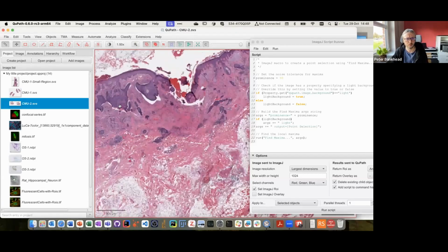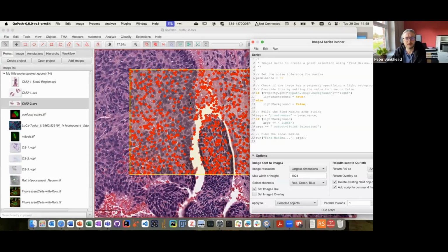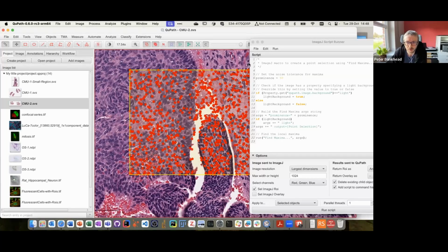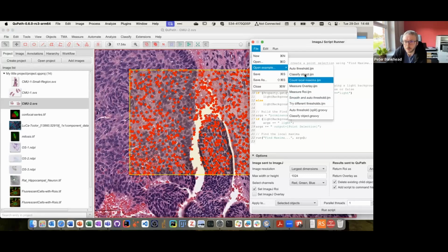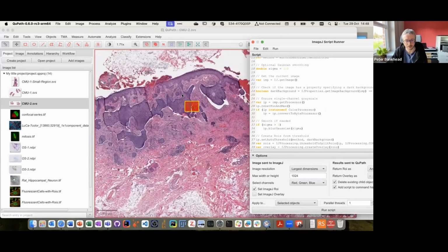Then you can see how some of these tricks work. Here's just another little one, which I did not try in advance, so it's slightly risky to try now. The results are fairly terrible, but the point is that we could run a maximum or minimum detection command in here in the same sort of way. So there are different macros in here to do quite different things, including even classifying objects.